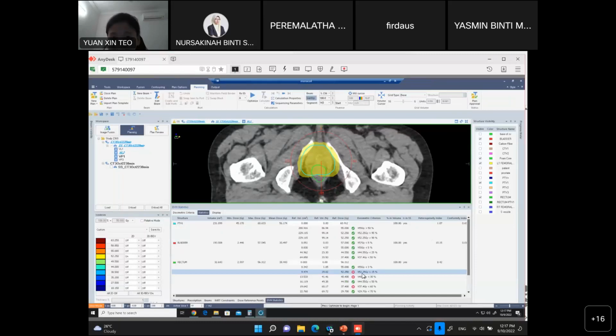But with the IMRT constraint we set just now, the computer gives us a plan with 29% receiving 52.25 gray, where the DVH is failing. This plan I cannot accept. So all these reds mean the plan cannot be passed.